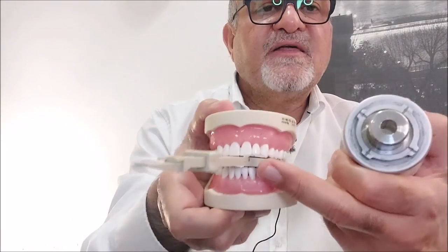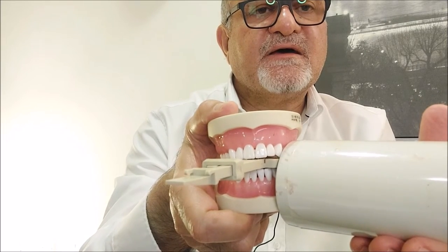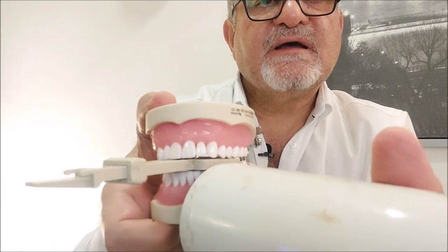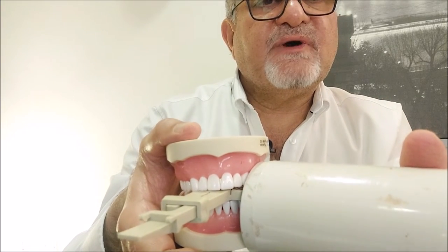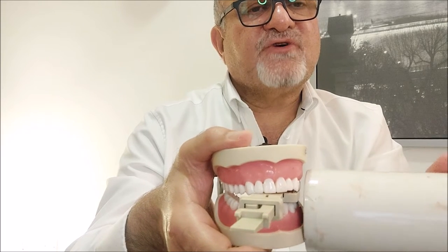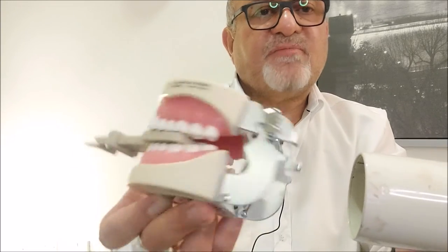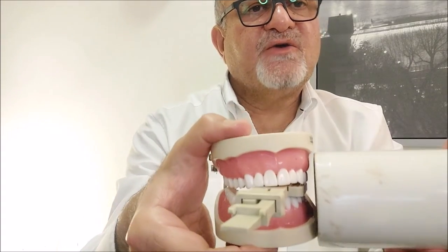For placement, as with the upper teeth, the margin of the sensor and bite block should fall within the outer rim of the x-ray tube — otherwise you will have a cone cut. Place it so it sits within the outer margin, then move the cone so it is perpendicular or parallel with the buccal surface of the teeth. You can give it a minus 10 degrees to compensate for the tilting of the film, then make the exposure.